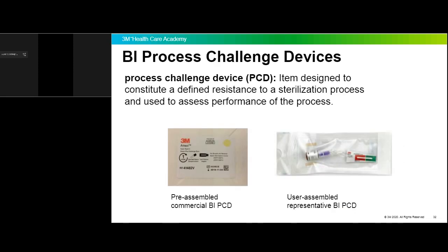And biological indicators aren't typically used just on their own. Just like most of you are doing terminal sterilization where your load items are contained or wrapped somehow, similarly, we put the BIs inside a process challenge device, and that's designed to mimic the challenge posed by packaging to the sterilization process.